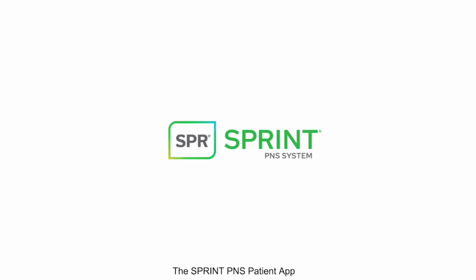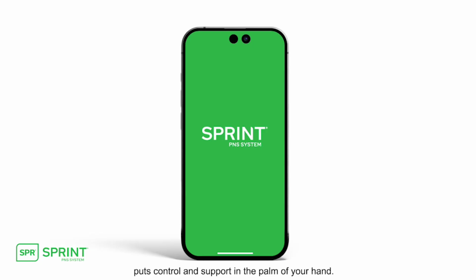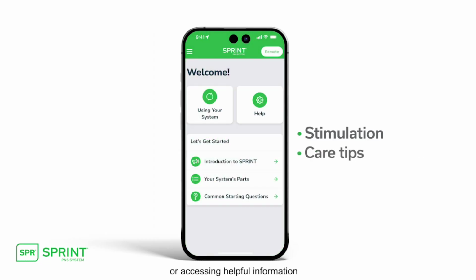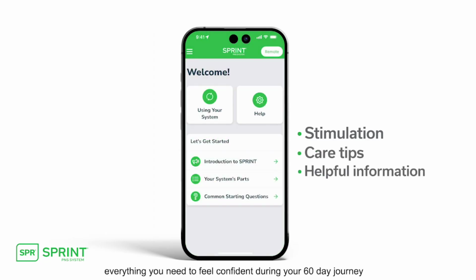The SPRINT PNS Patient App puts control and support in the palm of your hand. Whether you're managing your stimulation, looking for daily care tips, or accessing helpful information, everything you need to feel confident during your 60-day journey is just a tap away. This video will walk you through how to set up the SPRINT PNS Patient App on your mobile device.